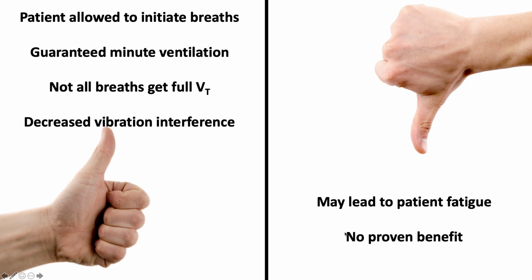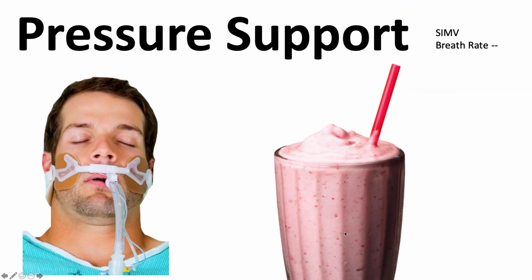One issue is that this may actually lead to patient fatigue, because again, it's allowing the patient to breathe as much as they want. And so if they're breathing 40 times a minute, they may tire out. And there's actually no proven benefit. At first, it was very exciting to get this mode in the hospital, especially because people thought maybe it could be a good mode for weaning people off the vent. But to this day, there really hasn't been much proven benefit. So people have kind of fallen back to using assist control.